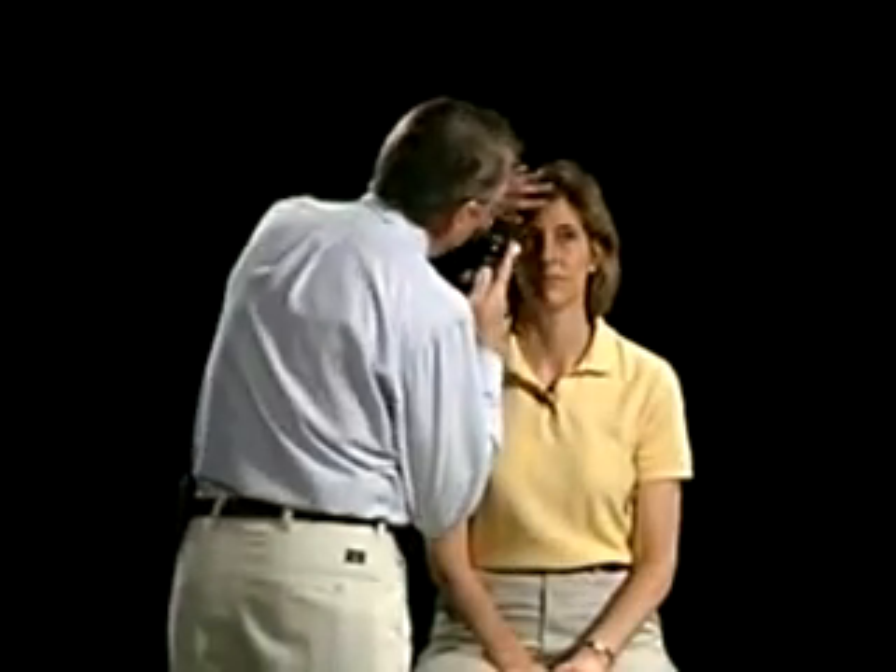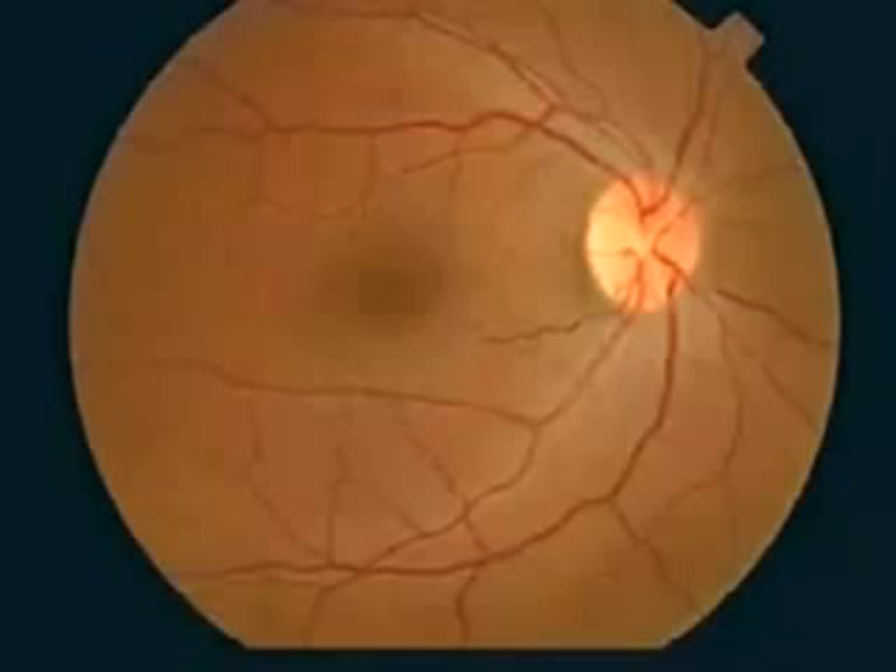I'm going to look at the back of your eye, and I want you to look ahead, but then turn a little bit out and look right there, and hold really still. I'm going to look back at the optic nerve head, looking at the disc margin, looking at the vessels, comparing the veins to arterioles, looking for venous pulsations, look at the background, and then come and look at the fovea. Very good.